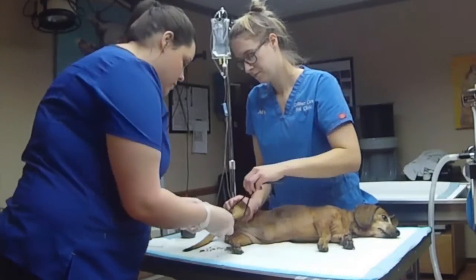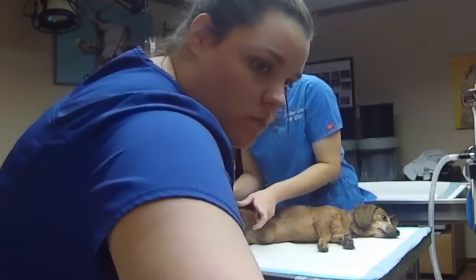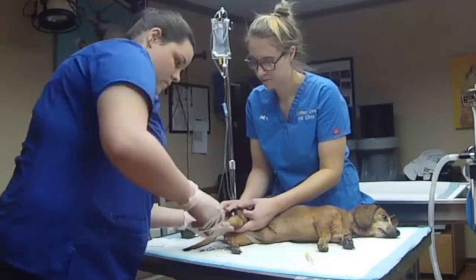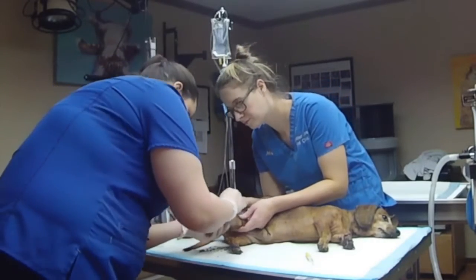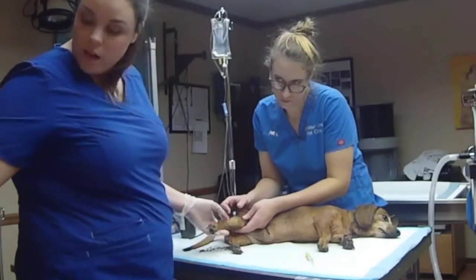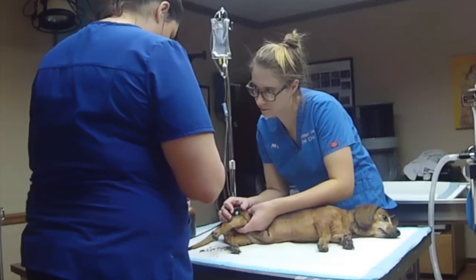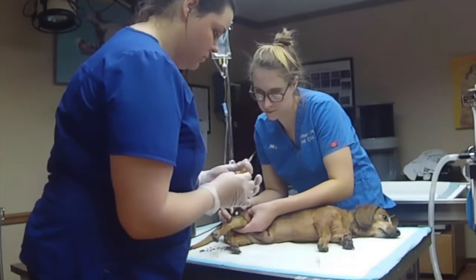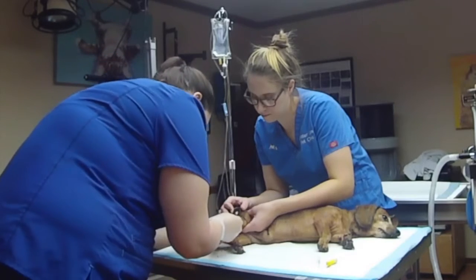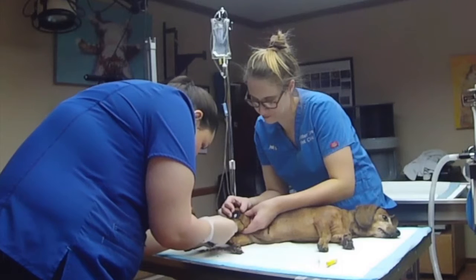And we're going to apply the tourniquet. I have a 24 gauge IV catheter. I've got my cotton ball with alcohol on it. Rub the area. You want to make sure your bevel's up on your catheter.